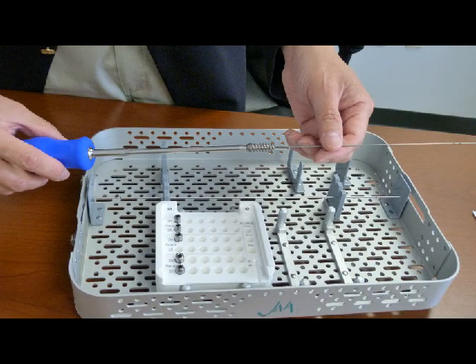Our screw comes in a sterilization case. It comes with a hex driver, guide wires, and screws in a caddy. The screws come in either 36 screws per caddy, or you can have two caddies, which would be 72 screws in the set. If it's a 72 configuration, then you add two of these side by side, like that.